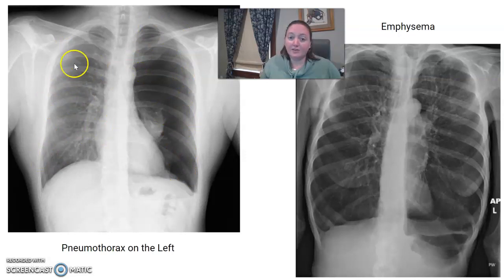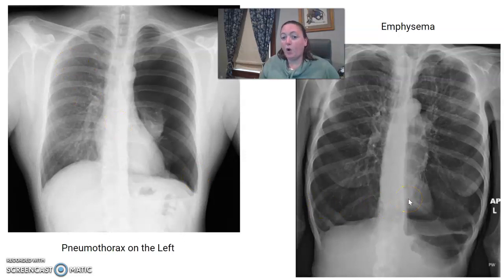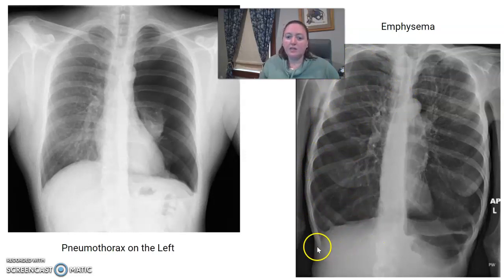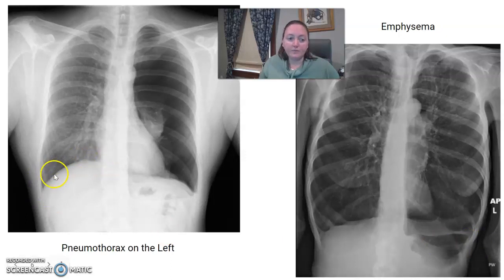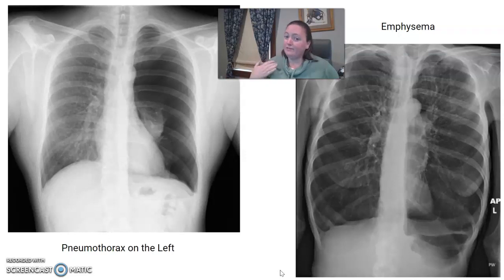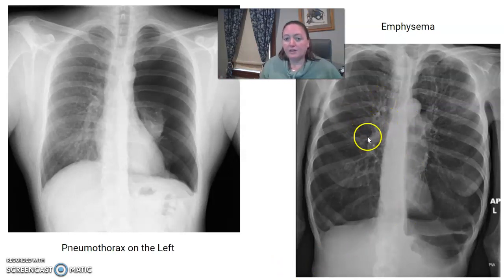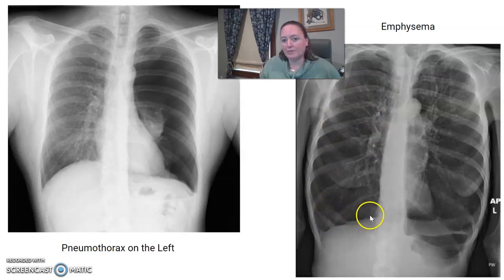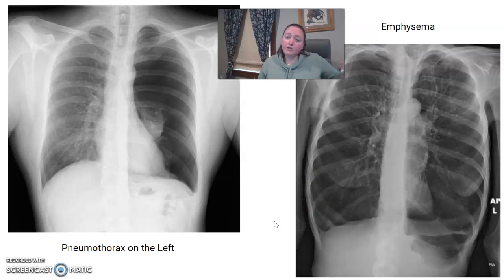This is normal lung with normal lung markings on the other side. Now this one is your emphysema. The lungs are over-inflated and come all the way out to the chest wall, giving very long lungs. If you look at the diaphragms, they look almost flat in appearance versus the normal arc between the angles. Over-expansion and a flattened diaphragm are common ways to pick up emphysema. Remember, these are your smoker patients — all that inhaling and exhaling from smoking has caused the bronchial trees, bronchioles, or alveoli to collapse, and the air is trapped in the lungs causing them to over-inflate. So these were your two destructive examples.